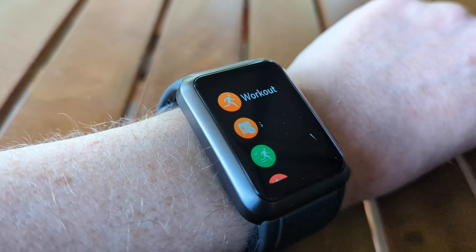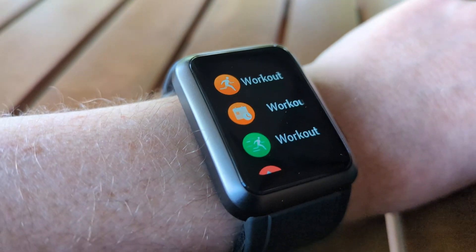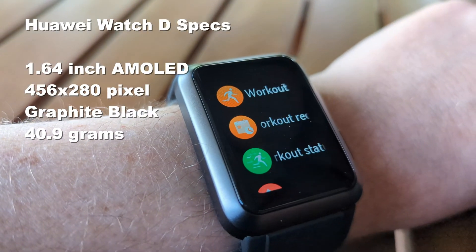Hey there, Alex Kidman. Today taking a look at the Huawei Watch D — that's this chunky little number on my wrist. Looks sort of like an Apple Watch Ultra in that it's big and chunky, but this is a very different kind of smartwatch with a very unique selling proposition.